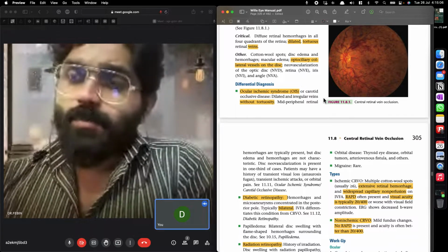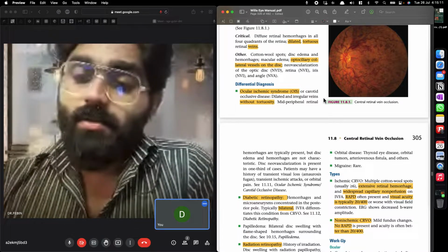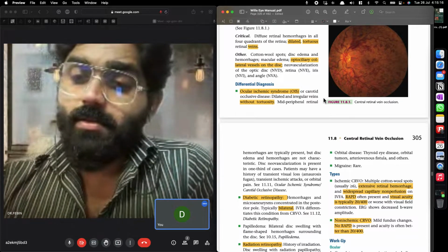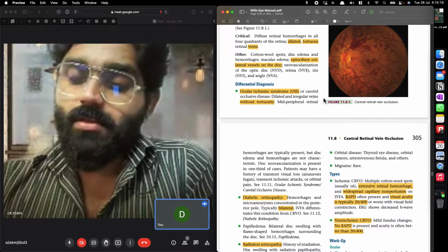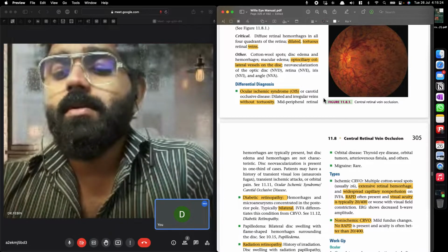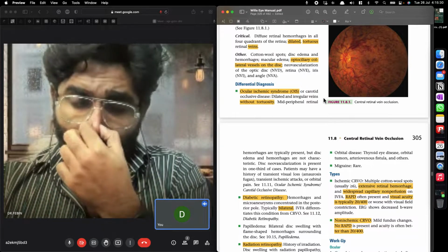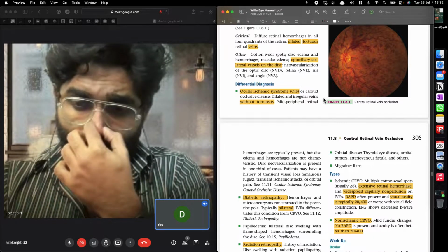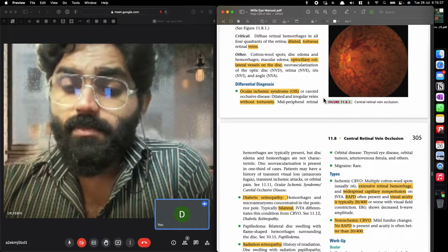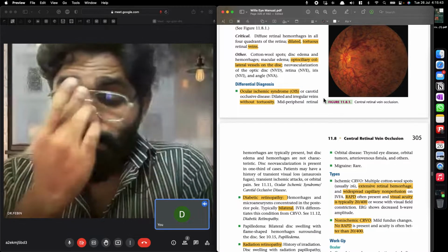I wanted to talk about ocular ischemic syndrome. Ocular ischemic syndrome doesn't exactly look like this, obviously, but it almost looks like this. There are scattered hemorrhages all across. But you know what is missing? The most important thing that is missing is tortuosity. It is not at all there. There is no tortuosity, and the space between the individual hemorrhages is relatively clear. The retina is surprisingly clear between areas of individual hemorrhages, not like diffuse flame-shaped hemorrhages all across all quadrants.